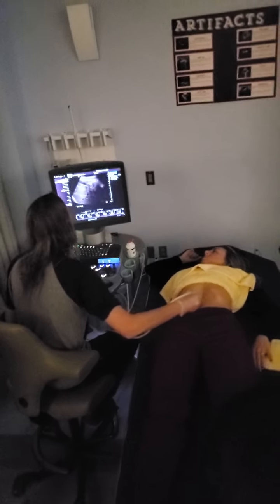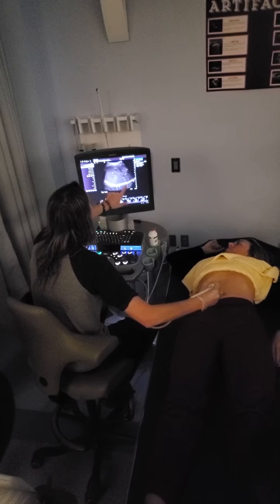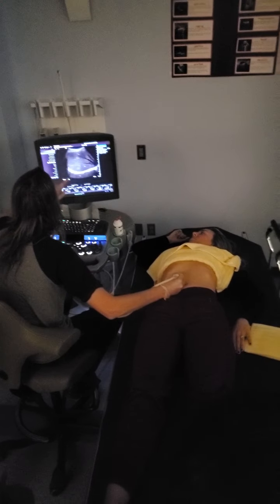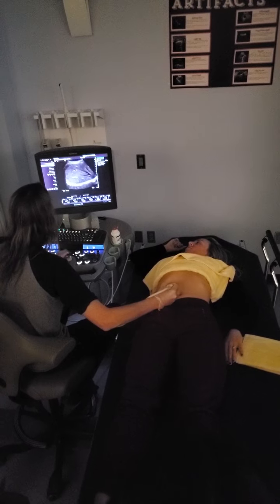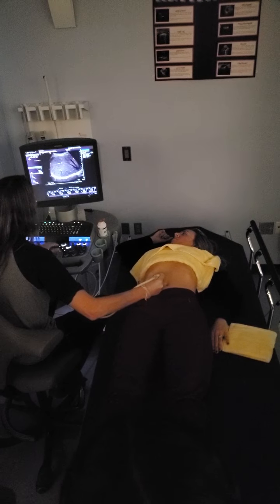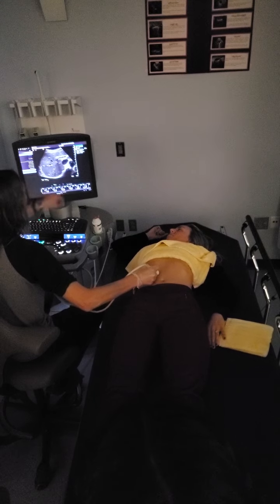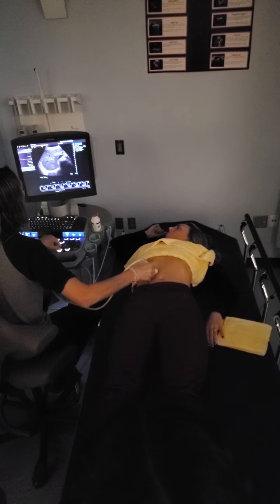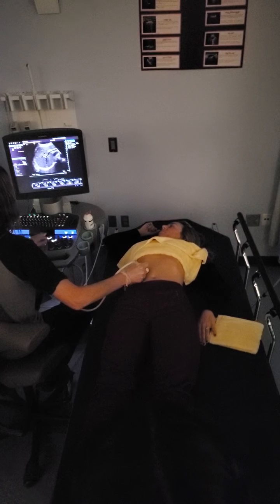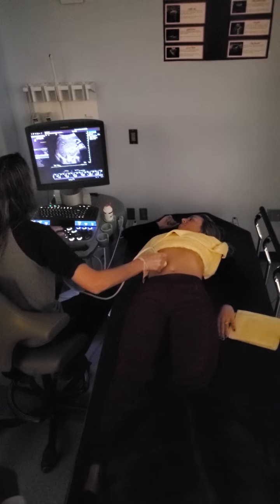Okay, when you're ready, big breath in. See your special window. So IVC here, we're going to go up past the hepatics. And sometimes this gets a little bit of dropout. As long as we can see that dropout, as long as we can see that border isn't cut off, we're good to go. So dome, coming down into hepatic land, coming down eventually into portal land. This is a left portal vein. We don't want that. We want the one that actually crosses the IVC. Oh, no, that wasn't one. There it is. Don't ask me, I've never done this before. And now we're down in kidney land. Maybe get rid of some of our depth. And there we go.